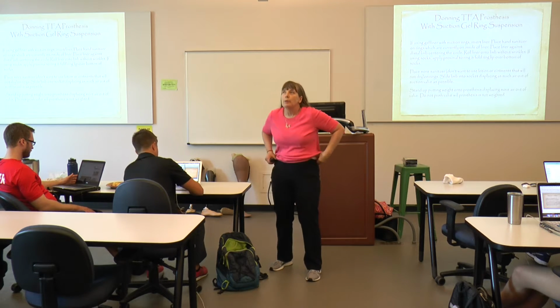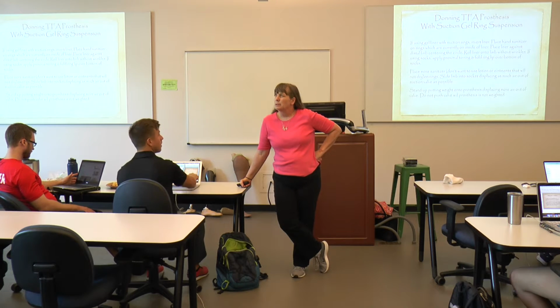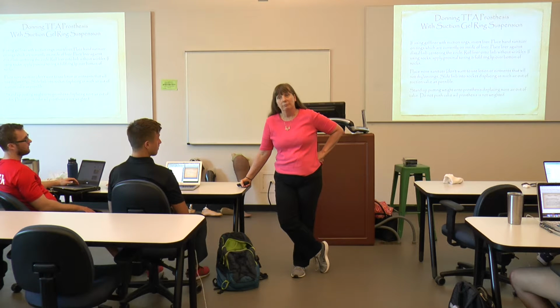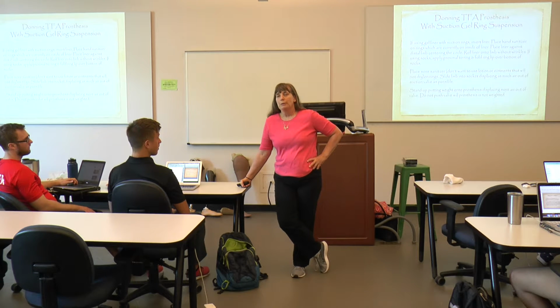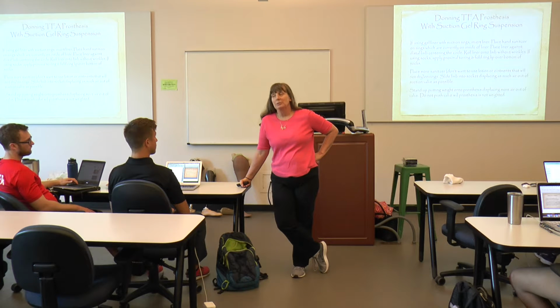I had a patient I was trying to help. She actually lubricated it with A&D ointment or something like that somebody told her to lubricate it with. She went to Myrtle Beach with her family. She stepped down off the curb. The entire prosthesis fell off because the ring was lubricated. And she fell. Her femur went through her distal residual limb and broke her hip. They were going to amputate at the hip. She was already a short limb, and she said no. She paid $800 personally to be transported via ambulance back to Greensboro from Myrtle Beach so that her physician could save her residual limb for the hip replacement. True story. All because she lubricated the suction ring.